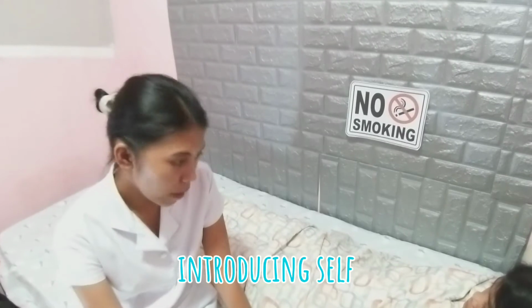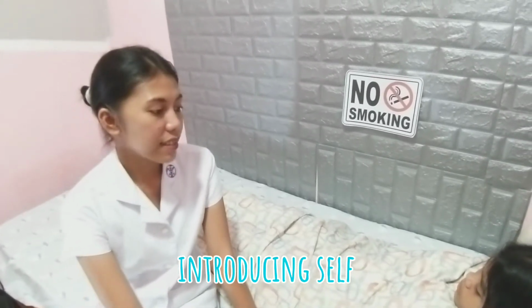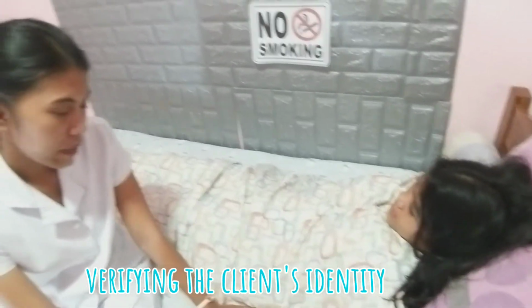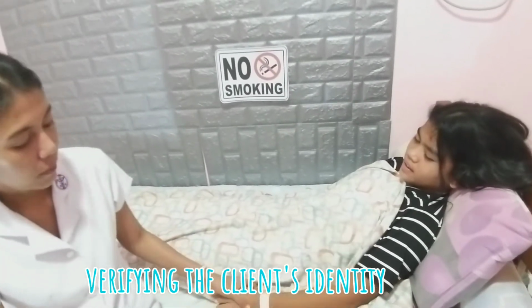This is to establish rapport with the patient and also verify that our service is being administered to the correct patient. Maayong buntag, ma'am. Ako ay si Administration-Policarpio, imong student nurse karon gikan sa Davao Doctors College. Pwede ko makutanong sa imong pangalan, ma'am? Jane Diaz. Yung birth date, ma'am? September 3, 2000. Okay, salamat.